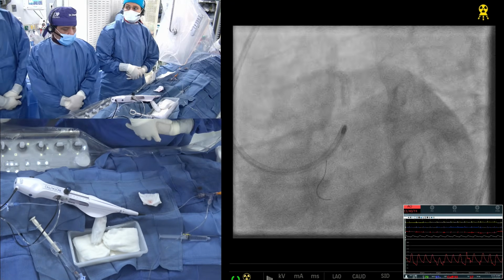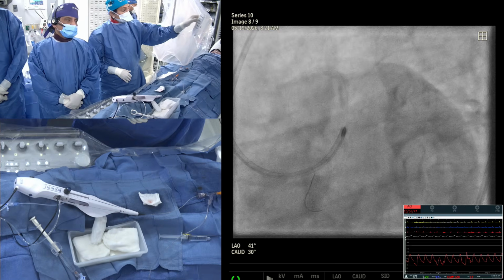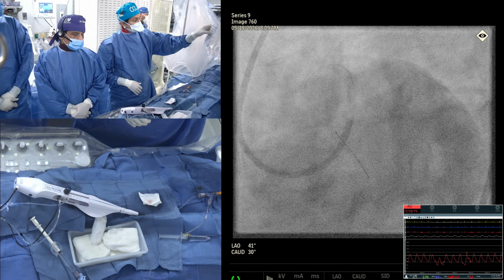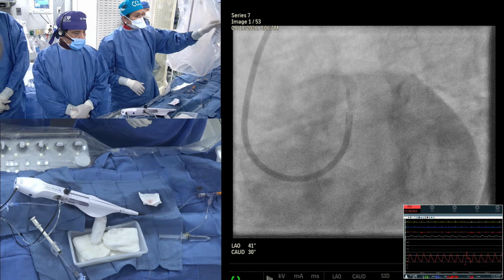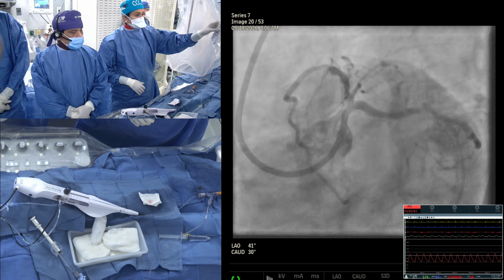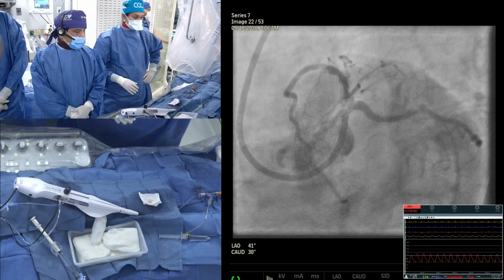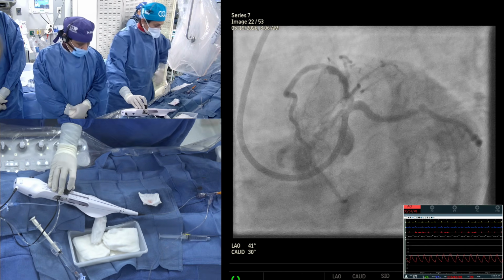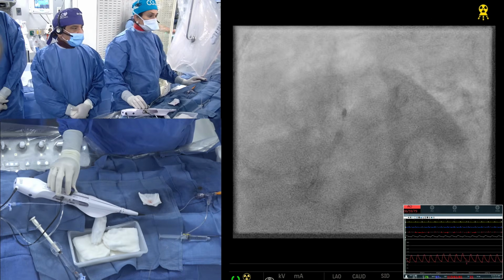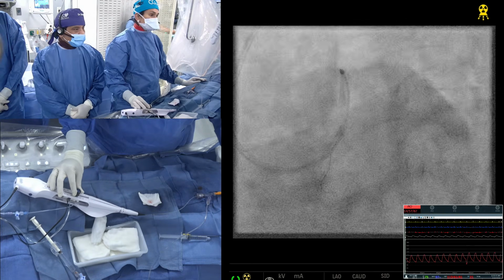And you saw the hemodynamics, no change, very nice advancement, slow, no jumping. As elegant a demonstration of rotational atherectomy as ever. Wonderful job. And we have two fellows here, Neil Kumar and Prithvi, and our same CVT, Asif and Naira, and our nurses, Will, Aldina, and of course, imaging Kiski when we need. Although Kiski probably wants to do it right away, we are probably doing imaging a little later.